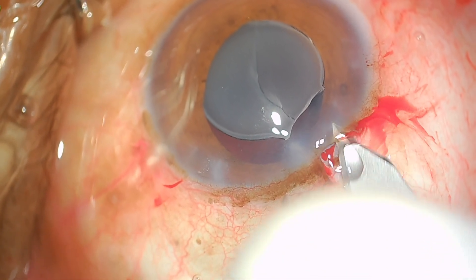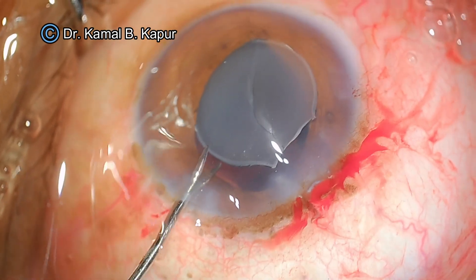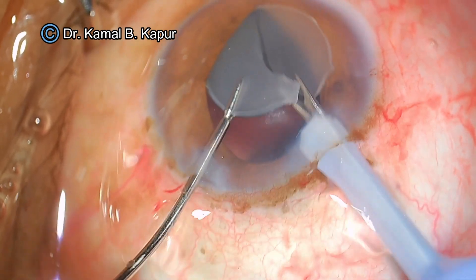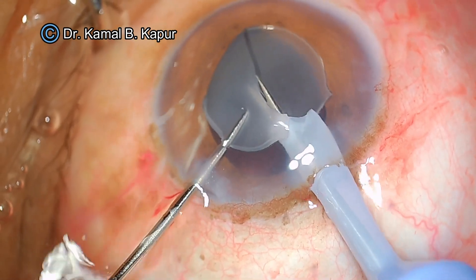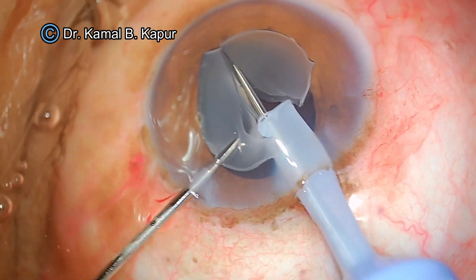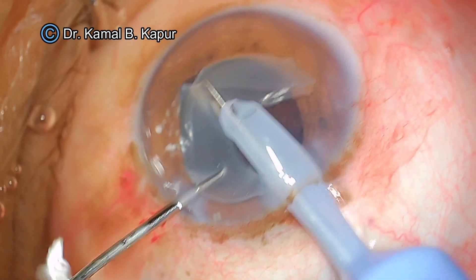I decide I will have to use the cutter again in the same manner. I enlarge the wound further because I need to pull out the pieces and this also makes insertion of the cutting tip with the sleeve easier. I use the same maneuver of engaging the IOL — the left hand pulling the IOL towards the cutter.